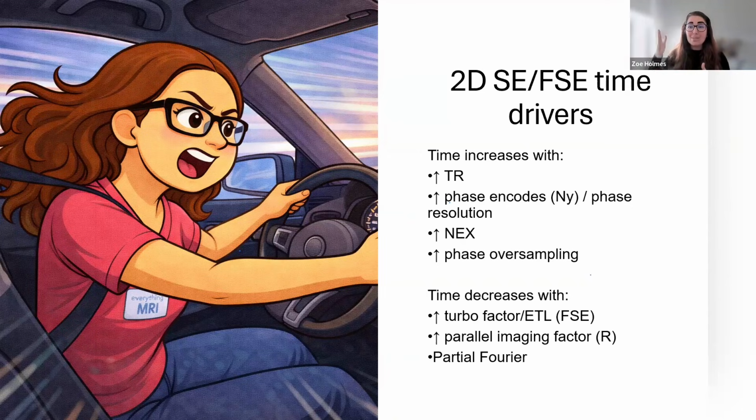If you need both speed and signal to noise ratio, you may need to adjust that voxel volume rather than relying on your acceleration, but you will pay for it with your resolution.